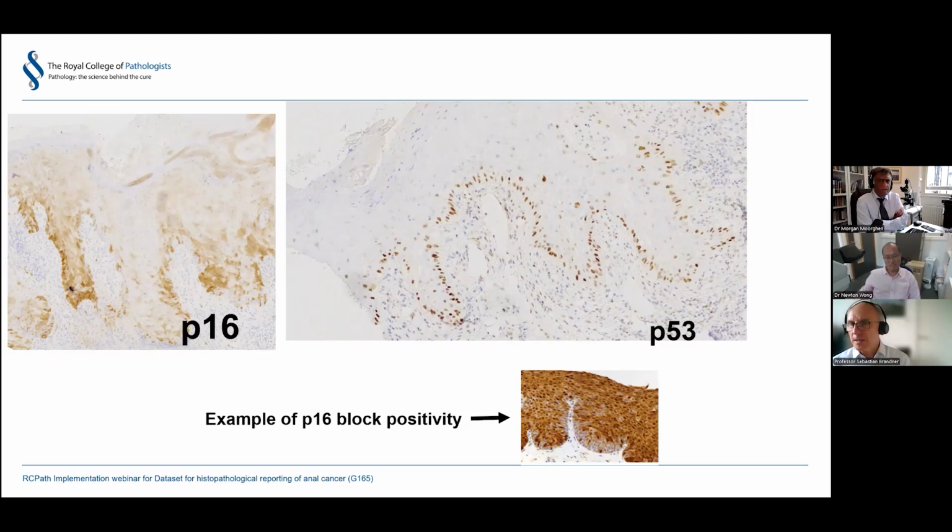And whilst you're doing this, I have a question regarding the P16, probably along the lines of the P53. How robust is it? Is there a prescribed antibody? Is there a multitude of antibodies? Are they pre-diluted tests which are standardized, like HER2, etc.? How reliable is it, and how much can you actually rely on it?